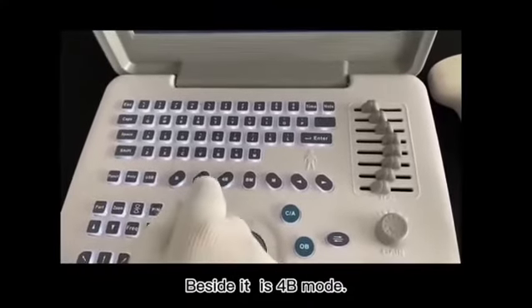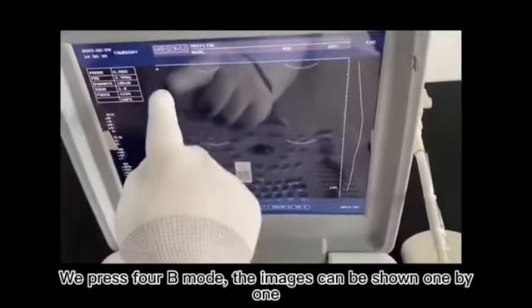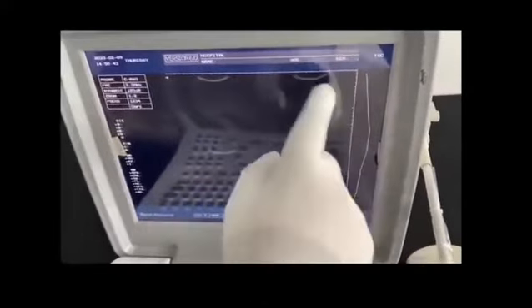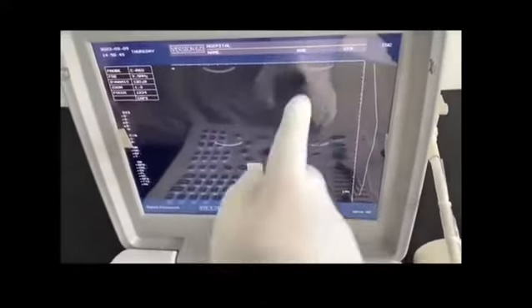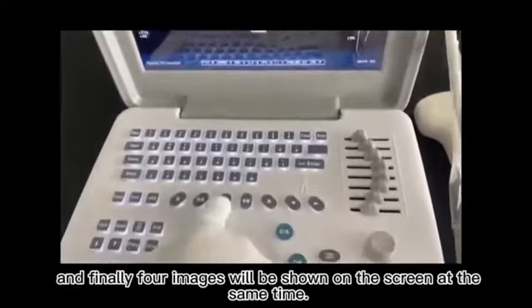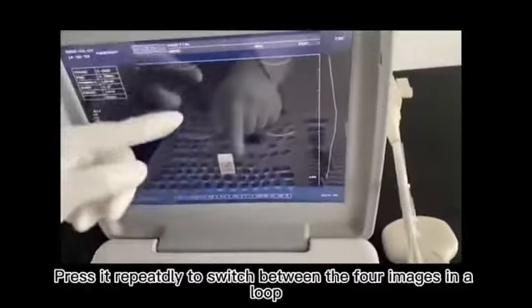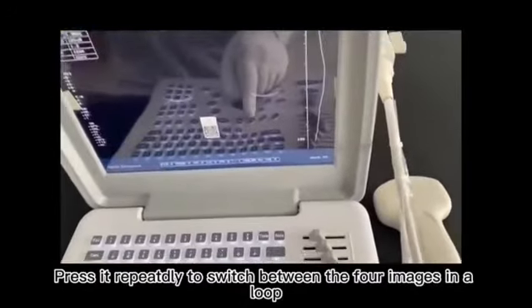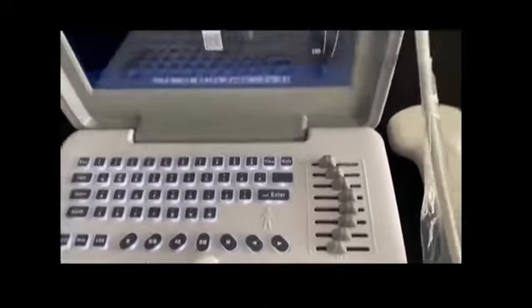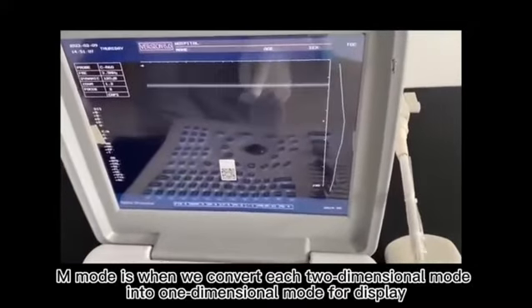Next is 4B mode. When we press 4B mode, the images can be shown one by one. And finally, 4 images will be shown on the screen at the same time. Press it repeatedly to switch between the 4 images in a loop. M mode is when we convert each two-dimensional mode into one-dimensional mode for display.